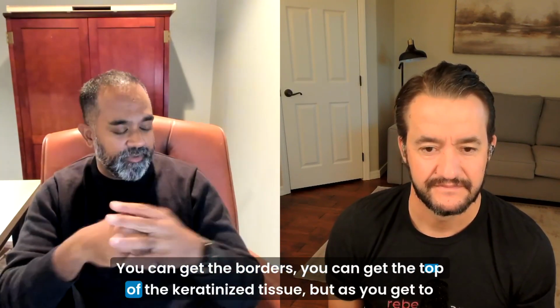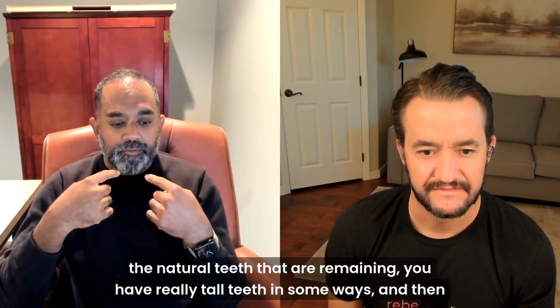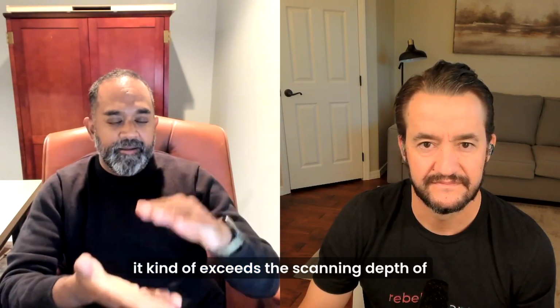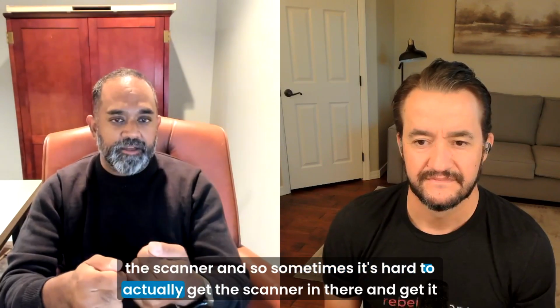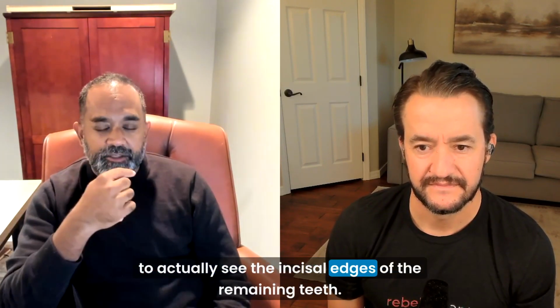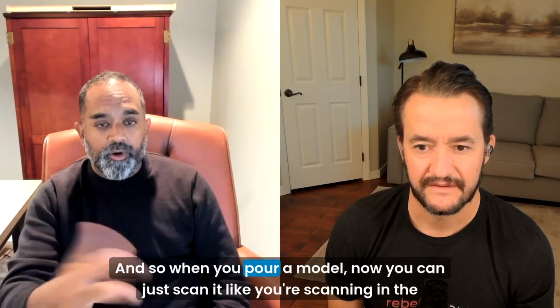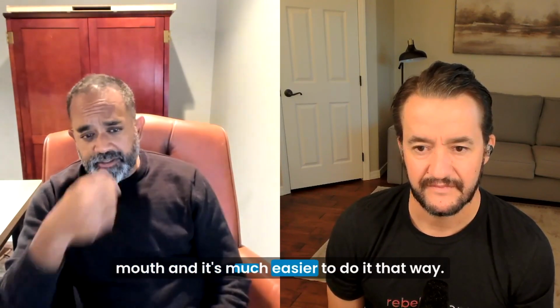You can get the top of the keratinized tissue, but as you get to the natural teeth that are remaining, you have really tall teeth in some ways, and then it kind of exceeds the scanning depth of the scanner, and so sometimes it's hard to actually get the scanner in there and get it to actually see the incisal edges of the remaining teeth. That's one issue. And so when you pour a model, now you can just scan it like you're scanning in the mouth, and it's much easier to do it that way.